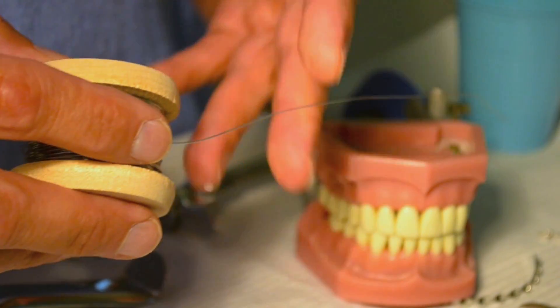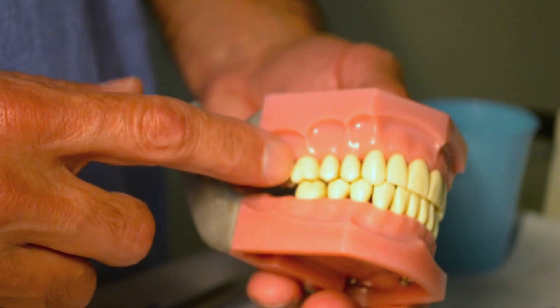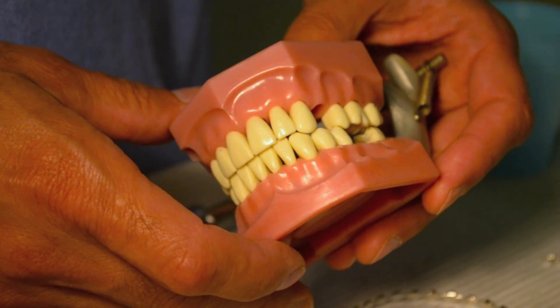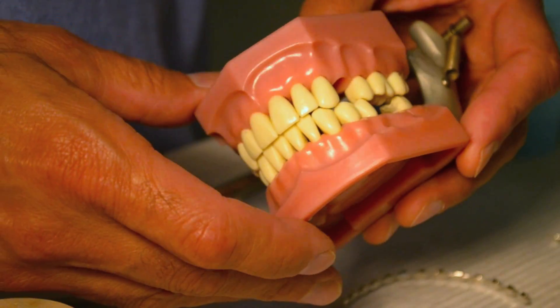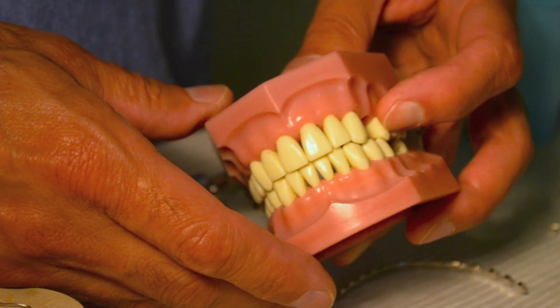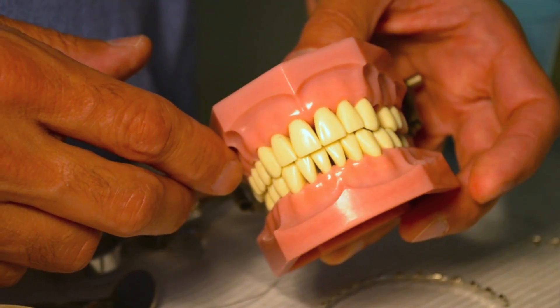After getting everything set up, I determine how I want to place my fixation — specifically how many teeth I want to involve in the arch bar fixation. Then I'll go ahead and measure the arch length and cut the Erich arch bar to the appropriate length. Looking at this typodont, I'm going to place the arch bar from the second bicuspid on the upper left, swinging it around to the first molar on the right side.